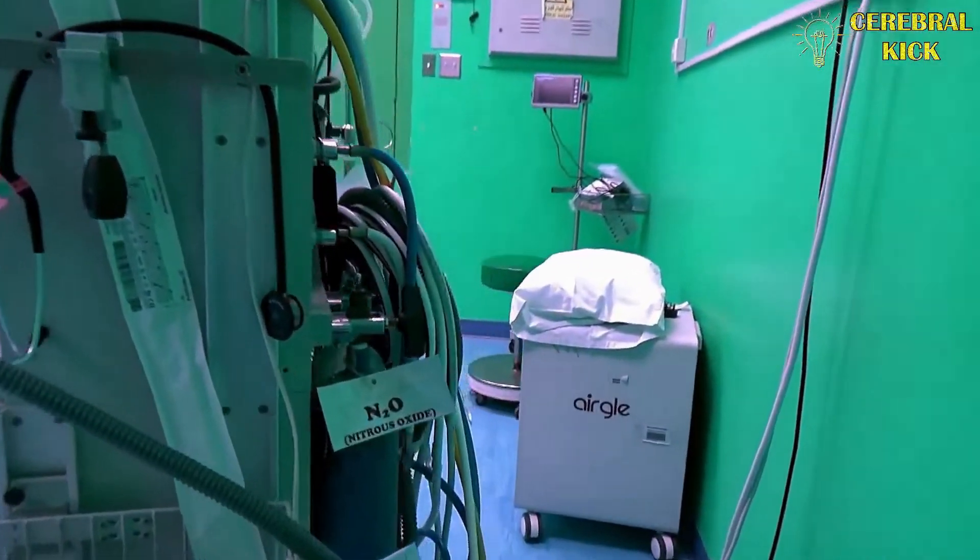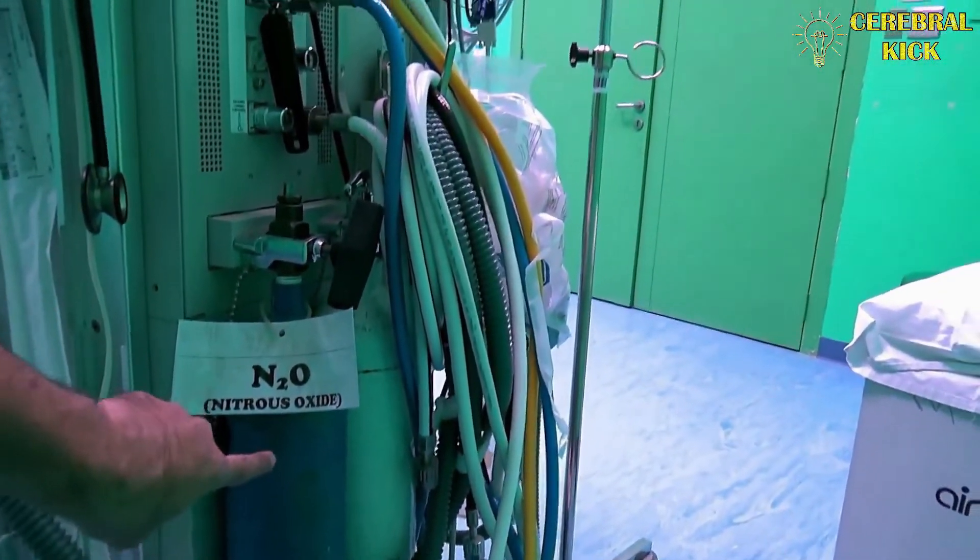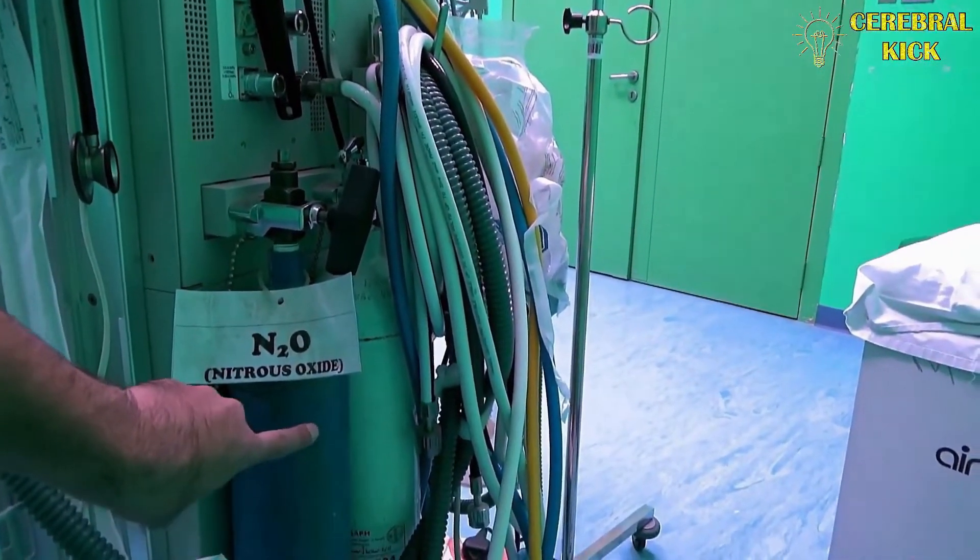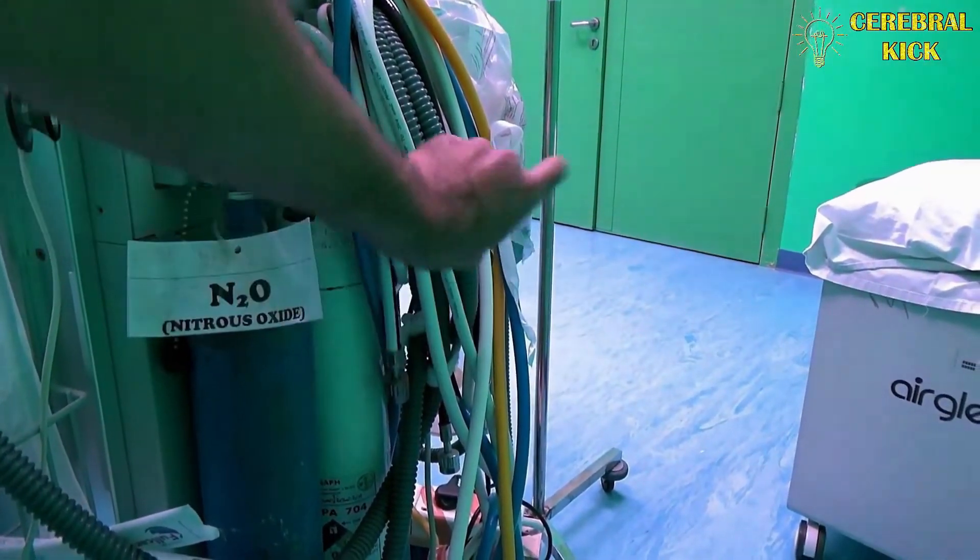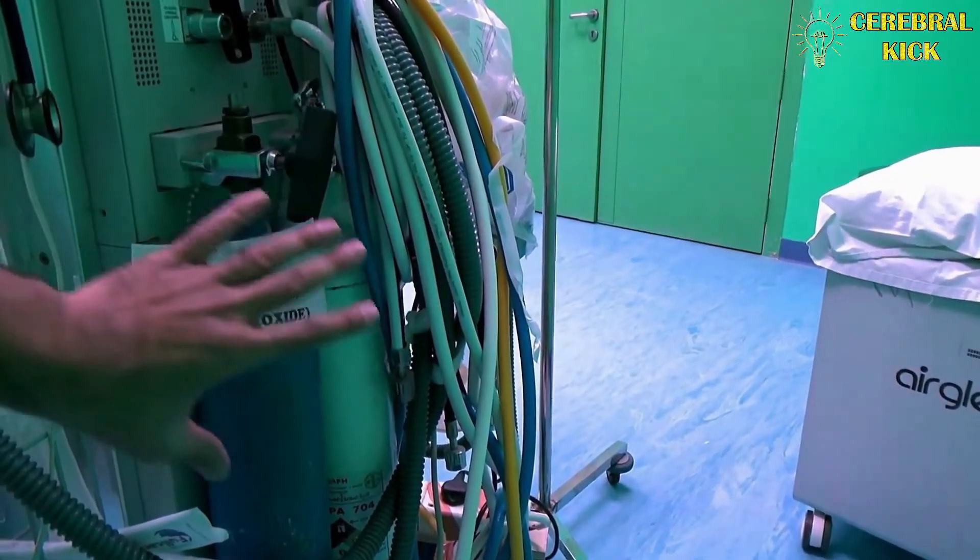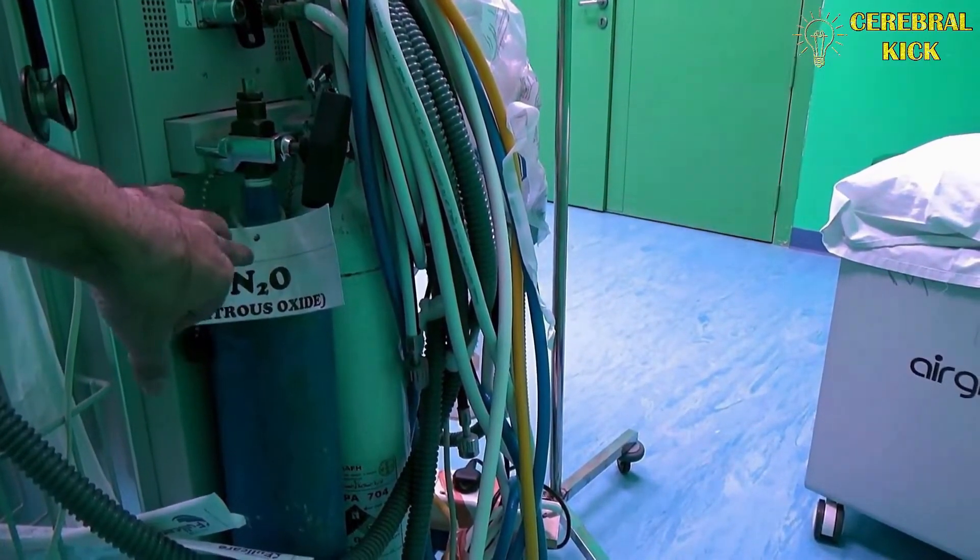The high pressure zone of the machine is located on the back side. The high pressure zone contains the cylinders - there's the nitrous oxide blue colored cylinder, the white oxygen cylinder, and then there is space for the air cylinder. This is the high pressure zone where the pressures are around 750 PSI for nitrous oxide to 2000 PSI for air and oxygen.